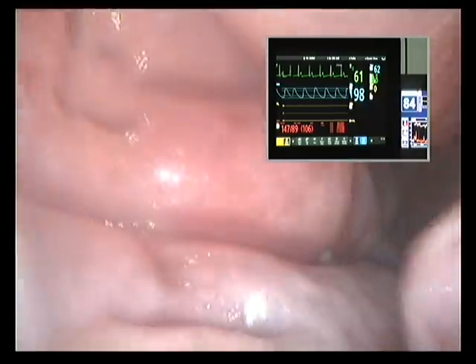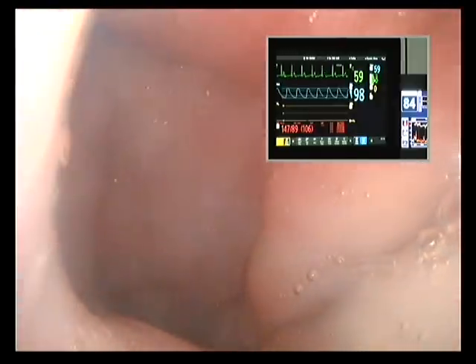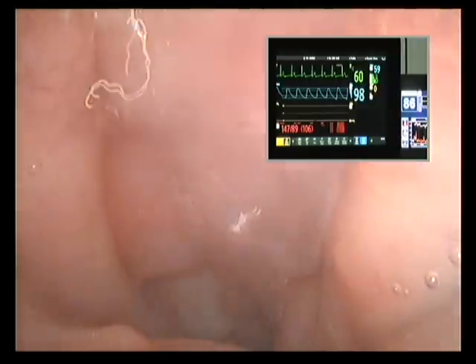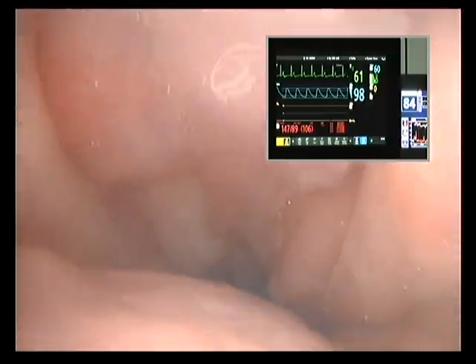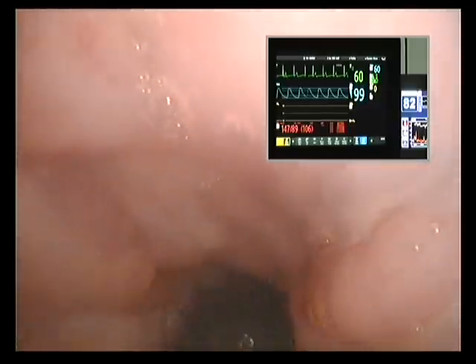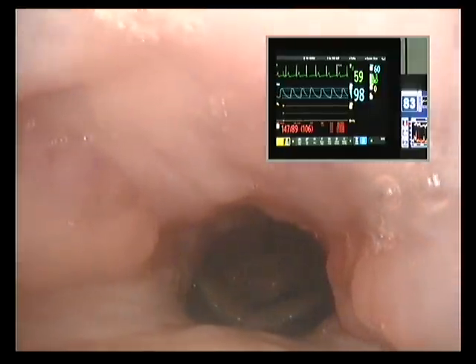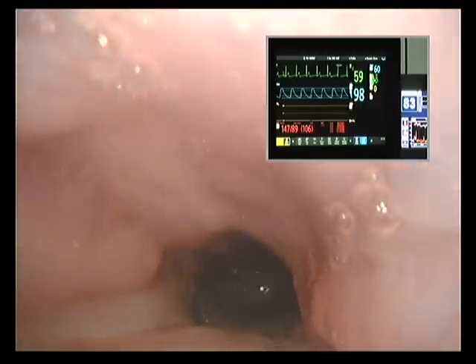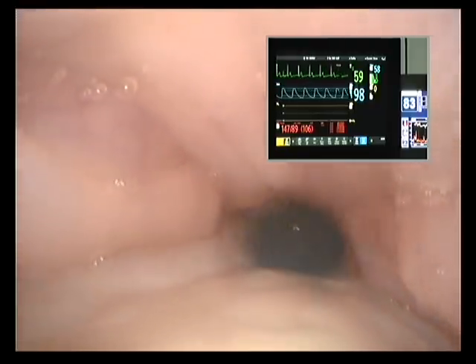We will ask the anesthetist to induce a little more sleep. The patient is already sedated with dexmedetomidine and some midazolam has also been added. We will wait gently for the sedation to take effect. As you can see, the BIS is reducing and coming towards 80. The range of 60 to 80 is where correct sedation for this assessment happens.